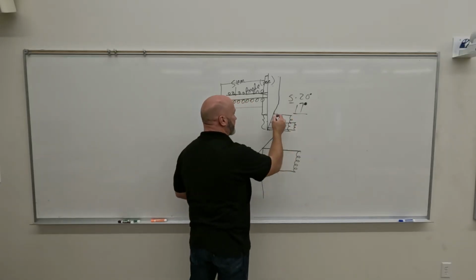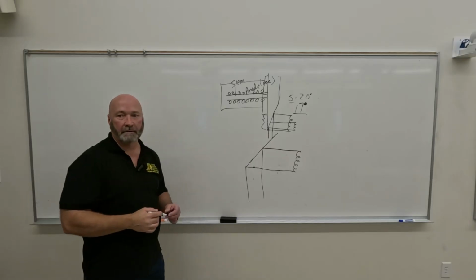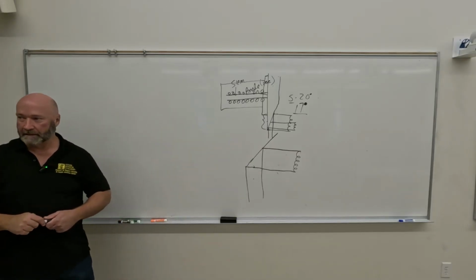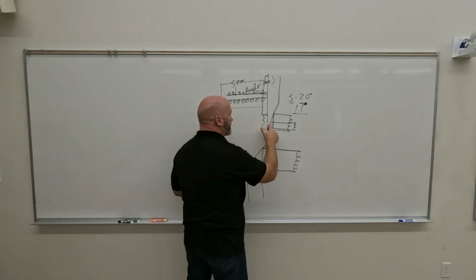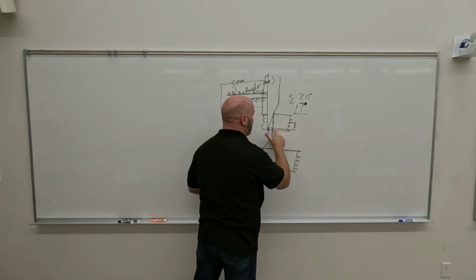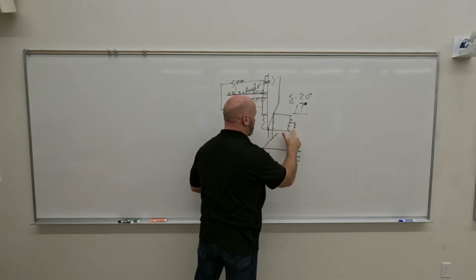When we come down to a 17-degree angle, then we get this. Our stream of photons is smaller than our stream of electrons. Okay? Everybody good with that so far? Let me erase the small focal spot stream so that it's not confusing.